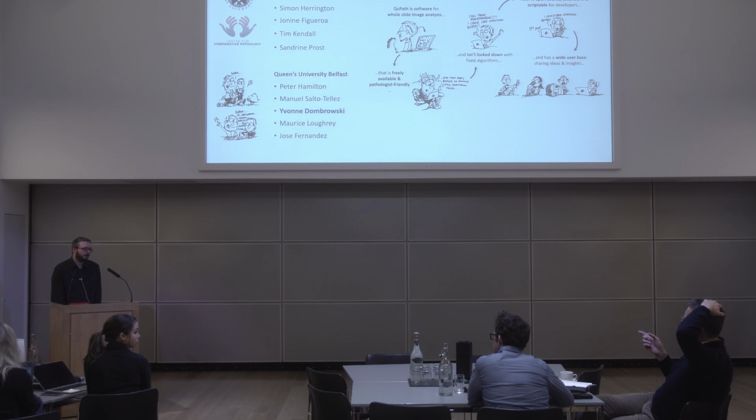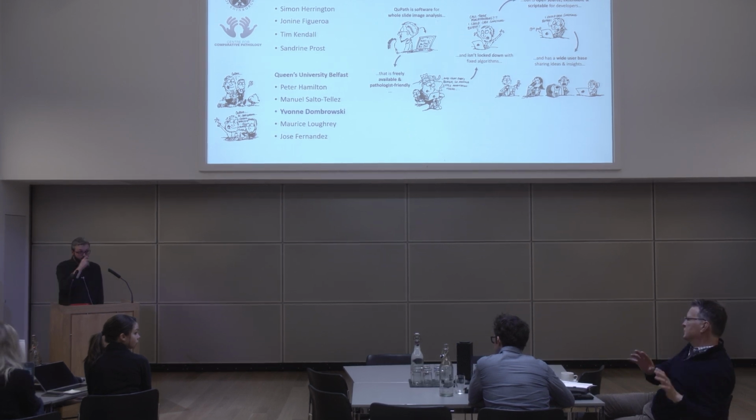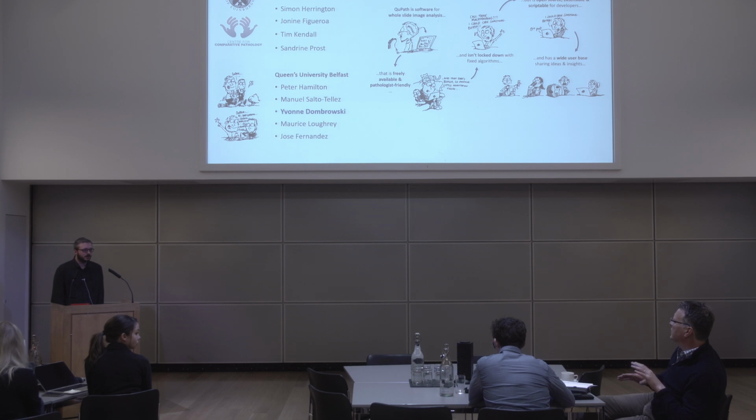Yeah, I guess my point is because many biologists are surprised that they've got to install a piece of software called Java on their computer just to run the tools. And now we've got this sort of divergence between what was a standard, which Oracle has been very unpleasant about, and we've got to solve that problem. I mean, it's not a problem for computer scientists or many of the people in this room, but it is a problem for biologists who don't have that background.